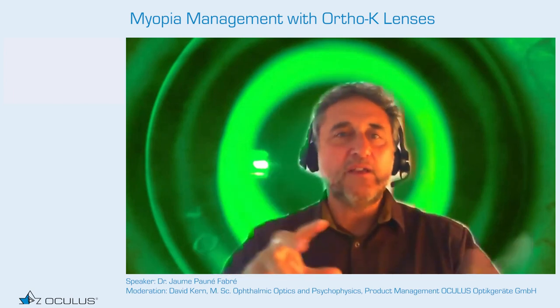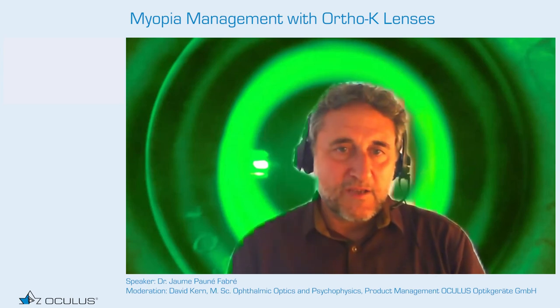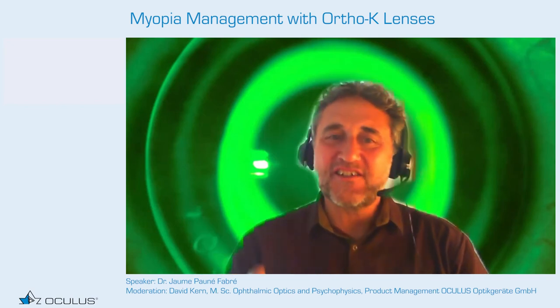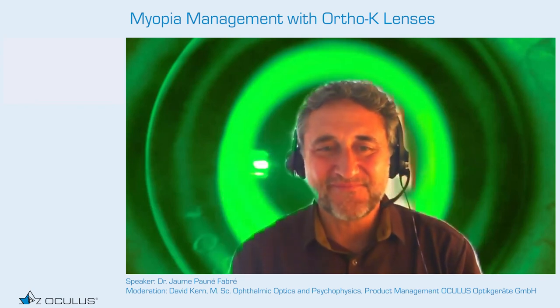So there are many things to look at. I don't do that. I don't measure that in my patients. I just look at the picture and with that I have enough. But if you want to click there, I recommend tangential and the most red point in the middle of the ring. Okay. Thanks. I think this answers the question.